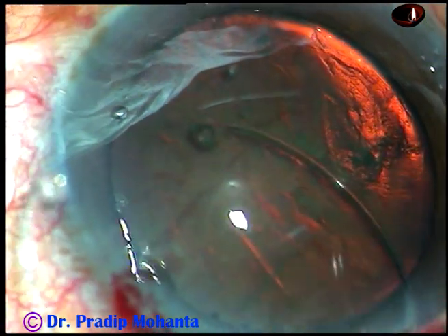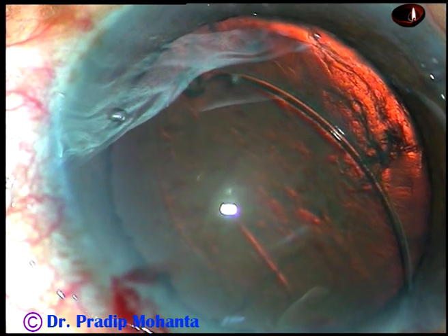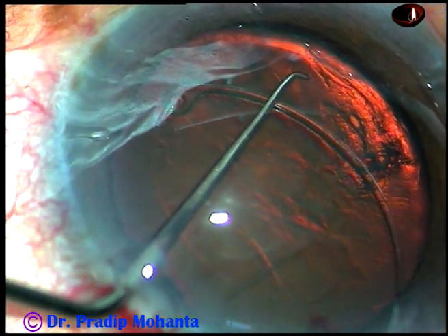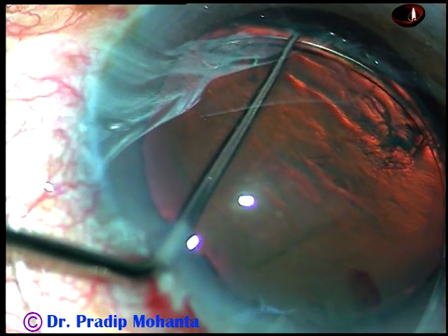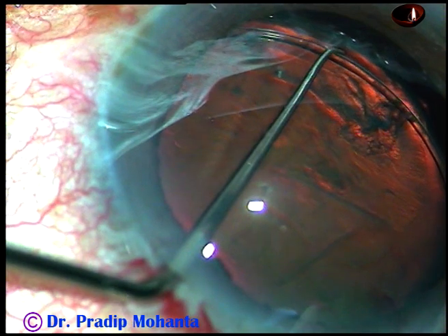Here goes the CTR. In such cases, if the rhexis is large, we should take the help of a Sinskey hook to guide the CTR into the capsular bag. If the Sinskey guides like this, the CTR will definitely go into the capsular bag.